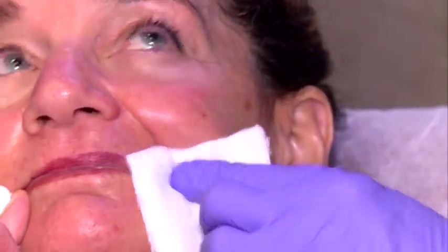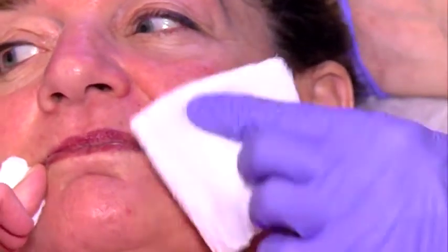It was less than 1 cc, 0.8 for the entire marionette lines. Okay? Can you see? Yeah, it makes a huge difference. Huge difference. Of course, it's not a miracle. It's not a lifting like this.